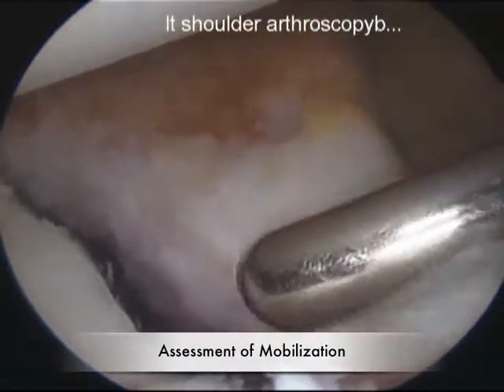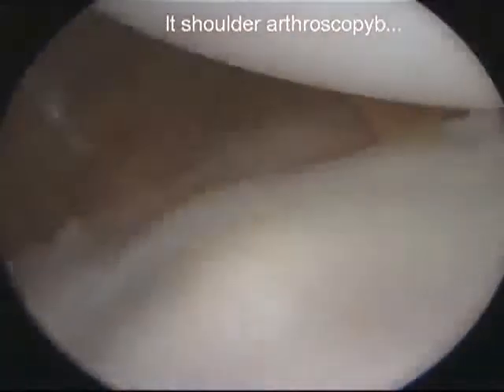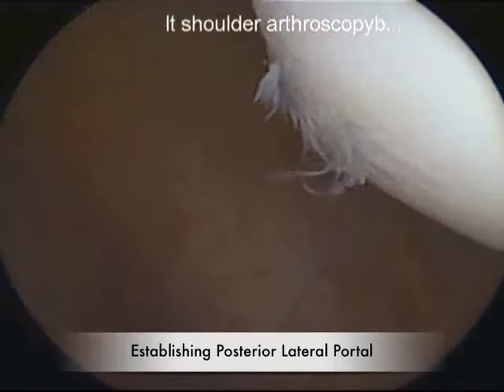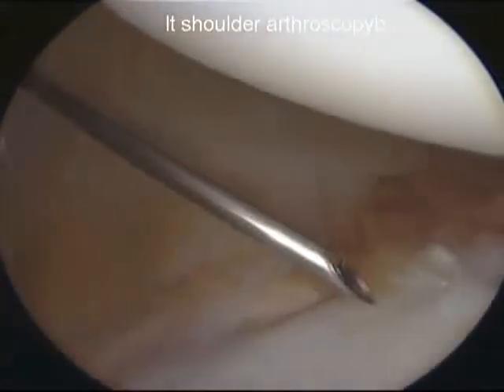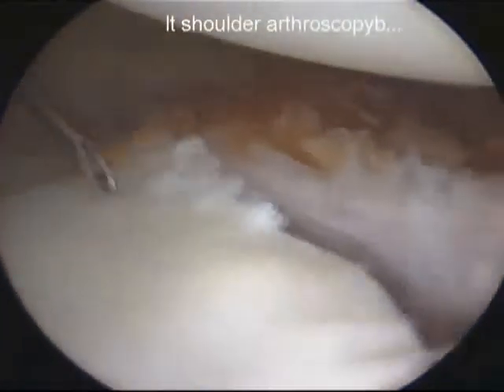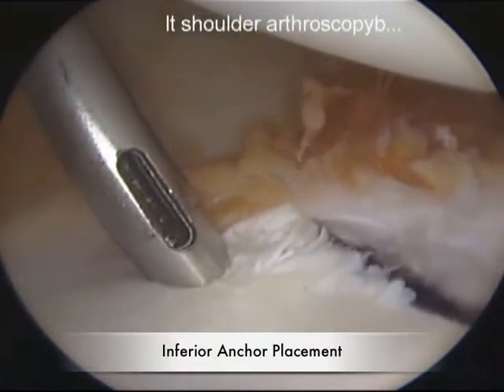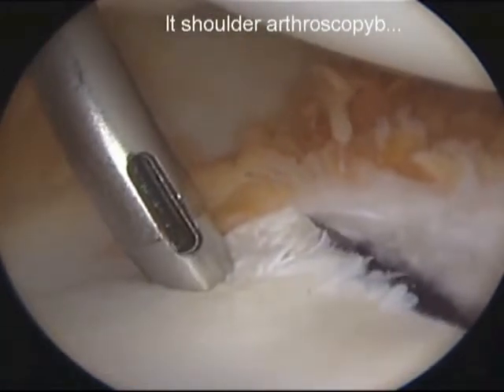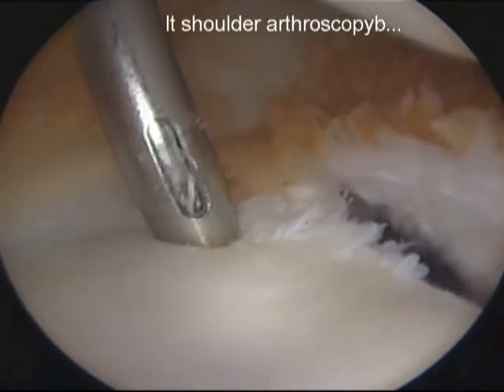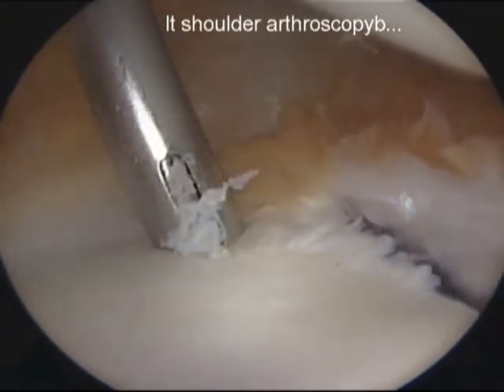Again, the fragment is assessed for mobility as the grasper is brought through the anterior-inferior portal. The posterior lateral capsule is palpated in preparation for inferior anchor insertion. A spinal needle is again utilized to confirm adequate accessibility to the inferior glenoid. A percutaneous entry is established for the anchor guide. The guide is placed at the glenoid edge, taking care to optimize anchor placement. The appropriate angle is maintained and standard drilling and anchor insertion is carried out.